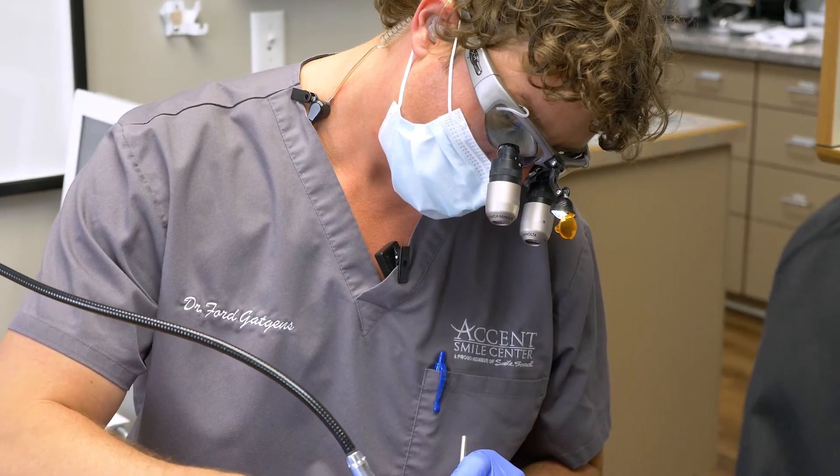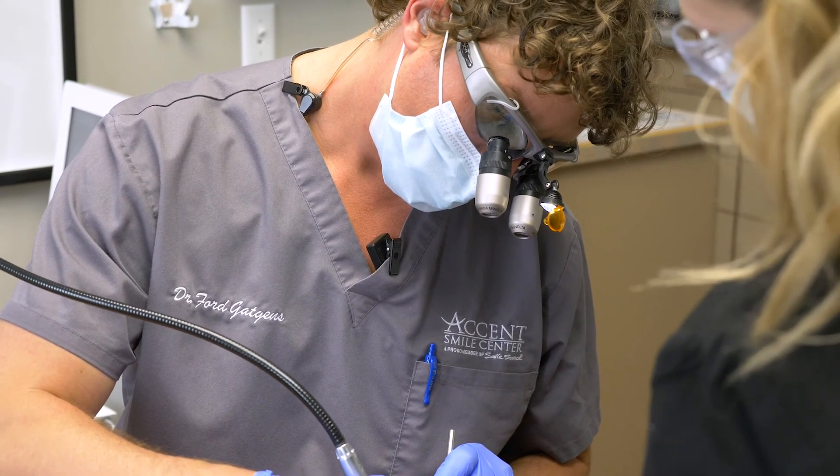I've been doing laser dentistry since 2010, and my current technique reflects lessons learned from past challenges, corrections I had to go back and make, and additional trainings over the years. We have really good success with this procedure.